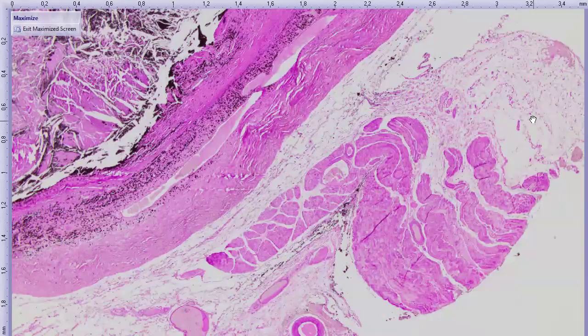No, we didn't. The clinical history is very brief and very ocular oriented. They were suspecting a melanoma, melanocytoma, on clinical history, but we don't have any other information. The only information on general medical conditions we have here is a geriatric patient with minimal veterinary history.